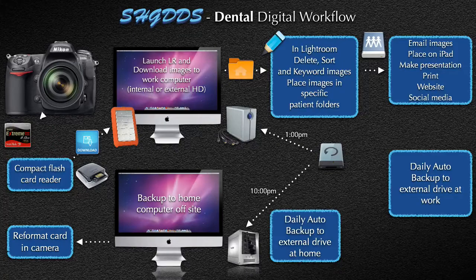This slide, which looks intimidating, and it's really not, is my dental digital workflow. So let me take you through this briefly. I'm going to shoot images. I'm going to take the compact flash card out of the camera. I'm going to place it into a compact flash card reader, and I'm going to download the images to an external hard drive. So if you look at the orange drive, that is where I store all my dental images. I don't store them on any computer because there's a finite size hard drive associated with a computer, of course, and at some point you're going to fill it up.